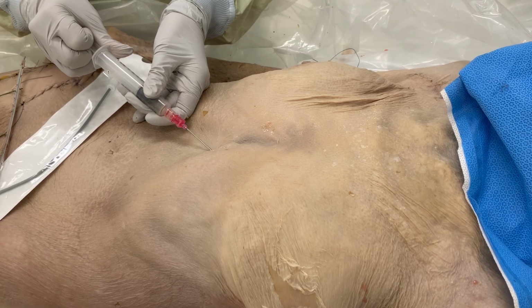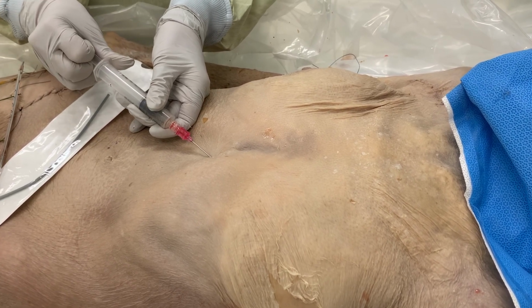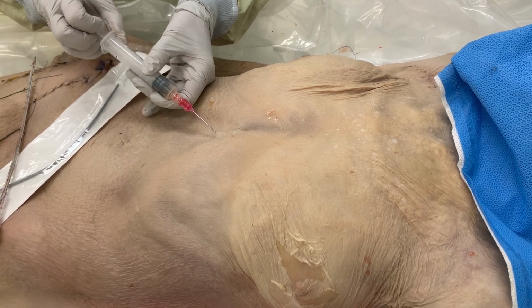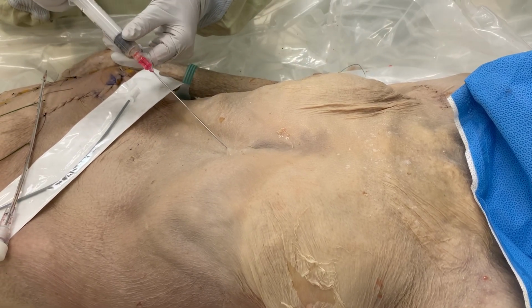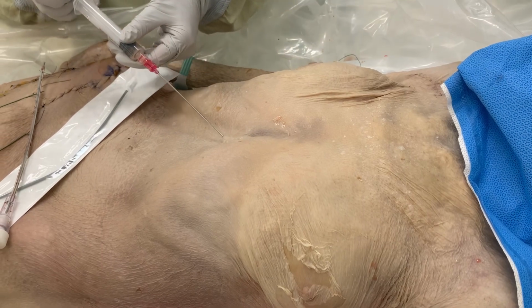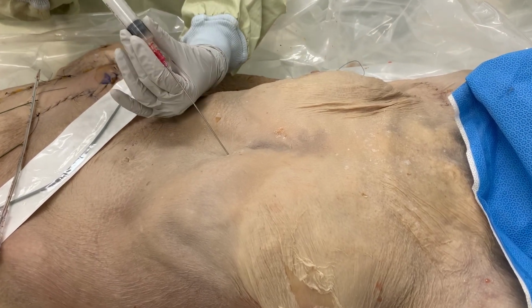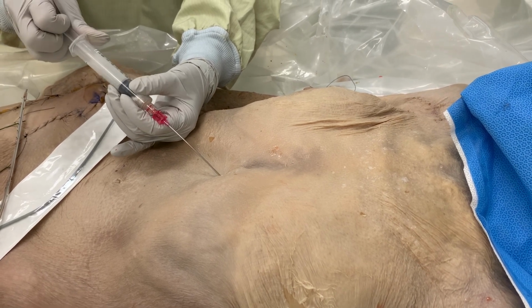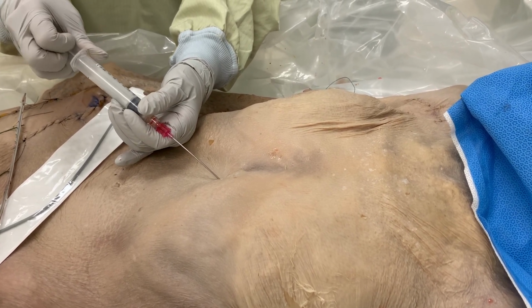Short, quick jabs, as opposed to slowly advancing the needle, are required to penetrate the parietal pericardium and to not tent it against the visceral pericardium. Advance the needle until fluid, blood, or air is obtained. It's important to note that air could indicate injury to the lung, such as a pneumothorax.